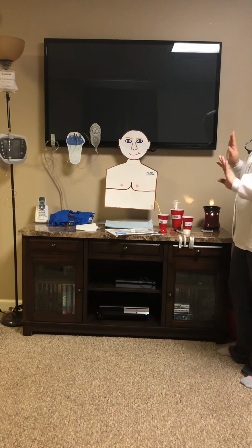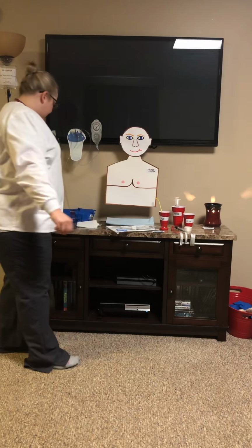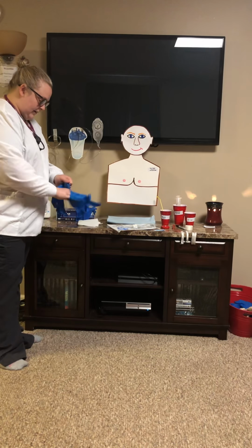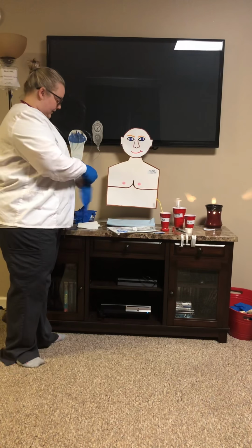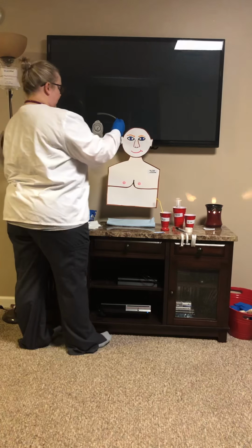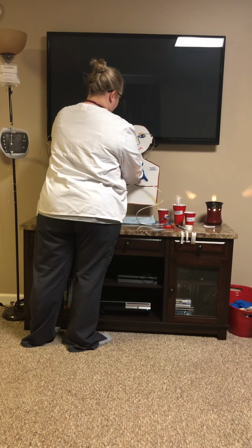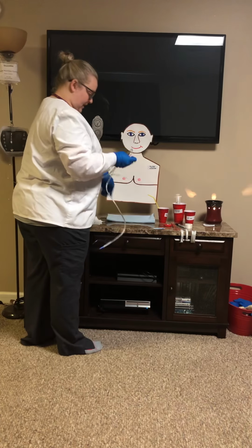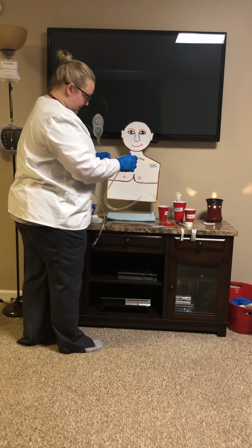I would put on my clean gloves and I'm going to measure the NG tube. Open my NG tube, and I'm going to measure from the nostril around the ear into the xiphoid process. I have it measured at 55, in which I will place tape so I will remember my markings.